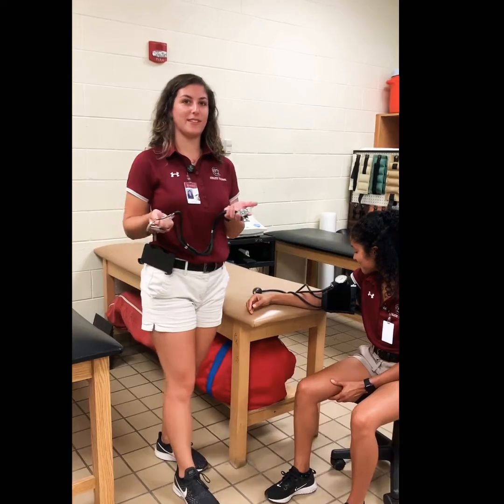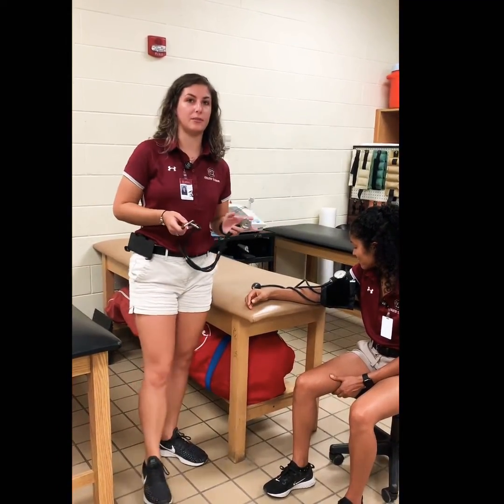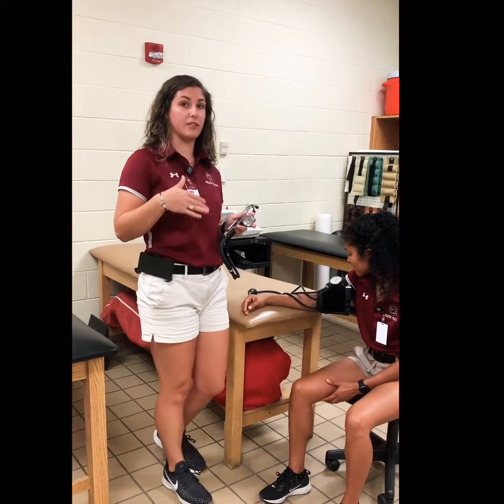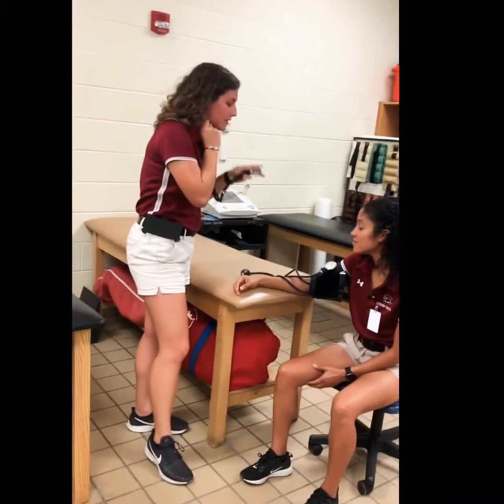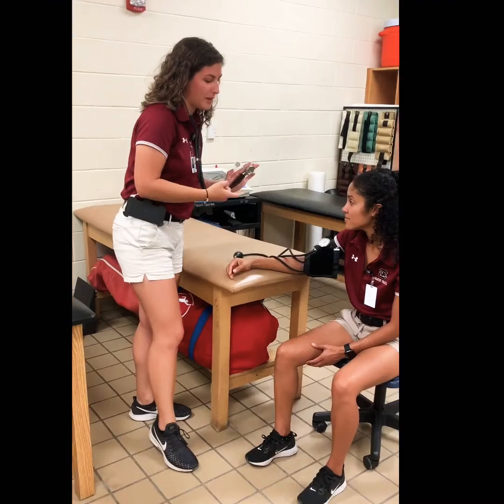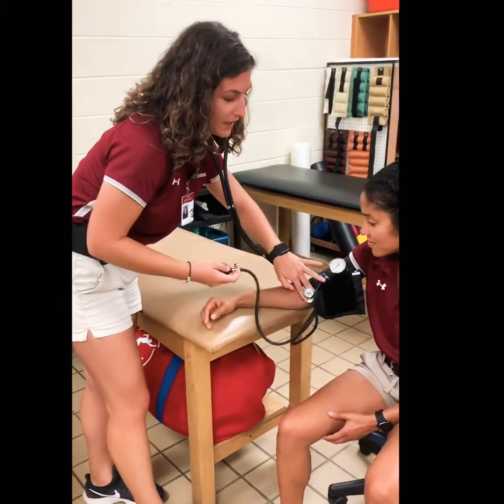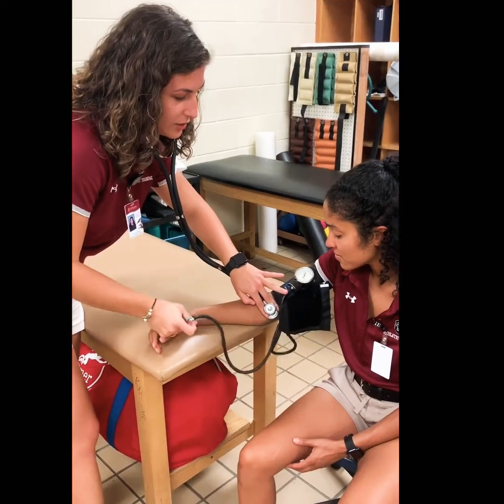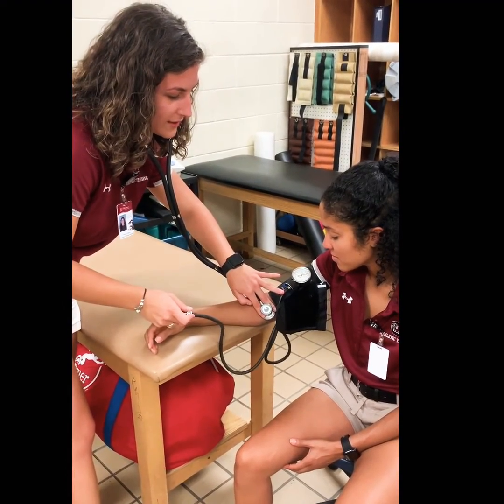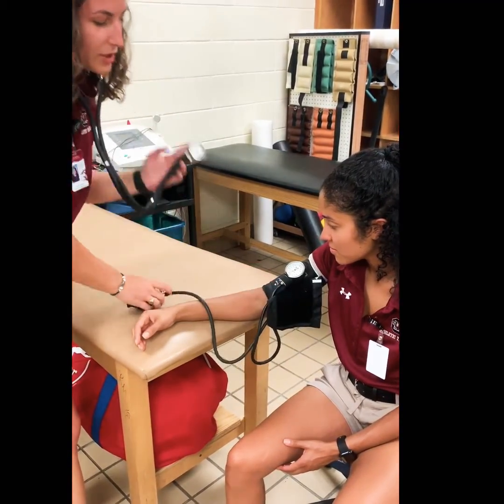You're going to use a stethoscope to listen to the Korotkoff sounds, and you're going to use the sphygmomanometer to figure out the pressure at which you hear those sounds. Put on the stethoscope, place the bell of the stethoscope on the brachial artery, and turn up the pressure and inflate the cuff until it gets to between 160 and 200. As you let out the pressure, listen for the first sound you hear and the last sound you hear.